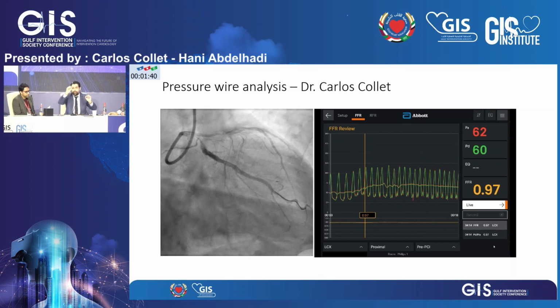If you go upwards, your sensor is going to be around 5 to 6 centimeters above your guiding catheter, and that induces some error in the measurement. That error is about 5 FFR units. So the normal FFR in the LAD in a patient lying down in the cath lab is 0.95. It cannot be higher. It cannot be 1, mathematically speaking. And that is very important.